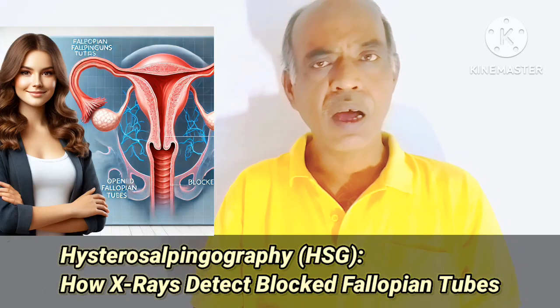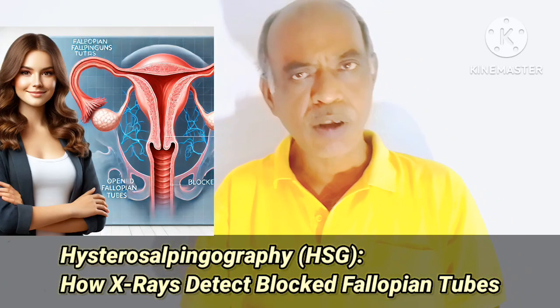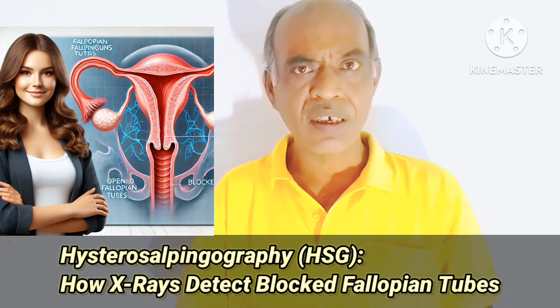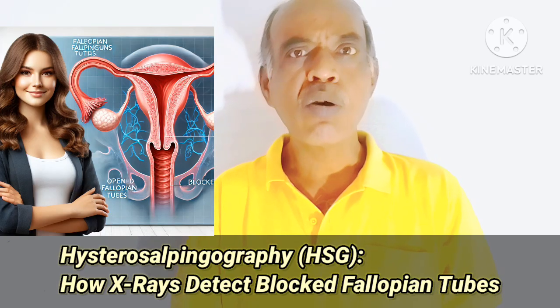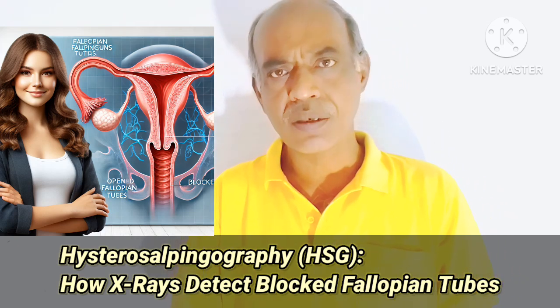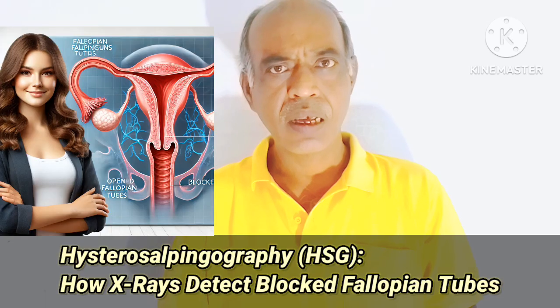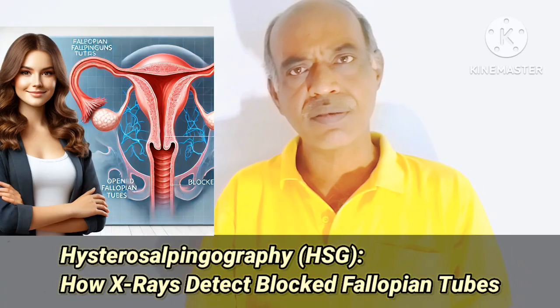But say doctors are using X-ray to examine whether there is a blockage inside the fallopian tubes. Fallopian tubes are soft tissues, so X-ray images alone are not sufficient to diagnose whether there is really any blockage or not. For that purpose, a radio opaque dye is used, which is a kind of contrast dye, and that is injected into the uterus.